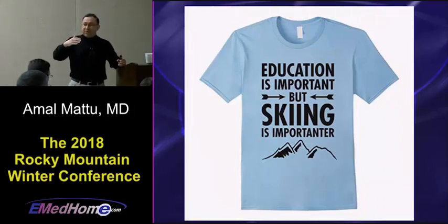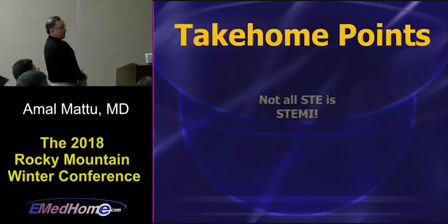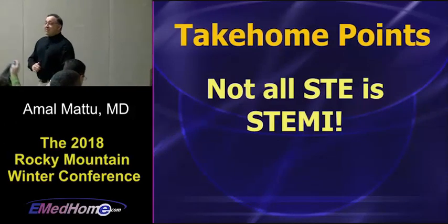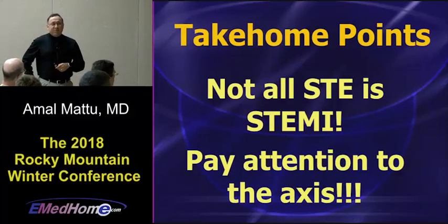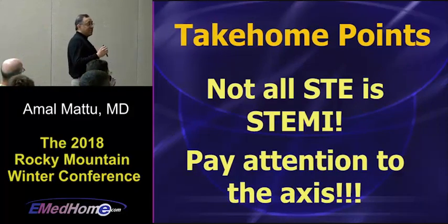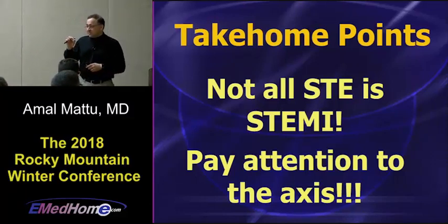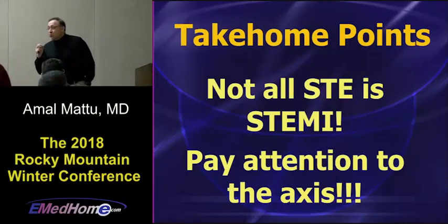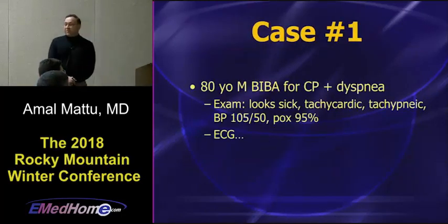So the next slide is my take-home points, and if you get these take-home points, you're welcome to head right on out. So in conclusion, number one, not all ST elevation is STEMI. And number two, pay attention to axis. It's one of those parts of the interpretation that I think people really don't pay attention to, but in this talk, I'm going to show you how sometimes axis, and in particular right axis deviation, can really, really be helpful. And missing this has resulted in a lot of miscues along the way. So let's start once again with the case.